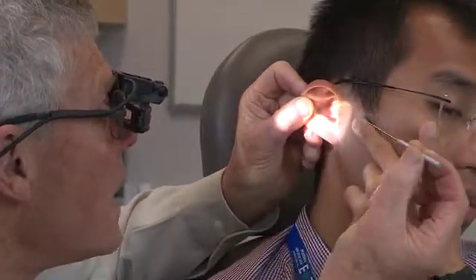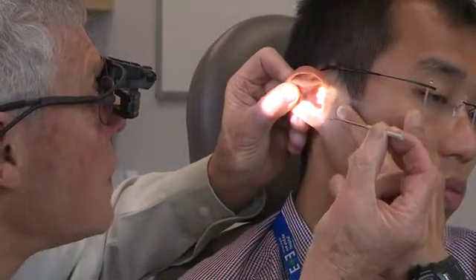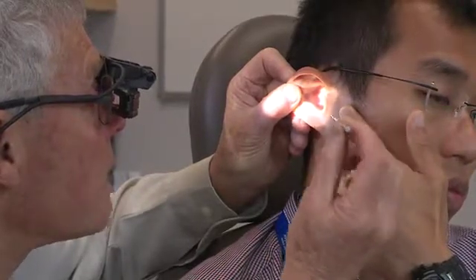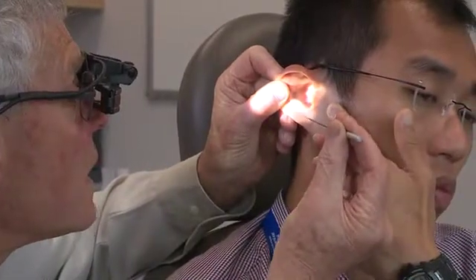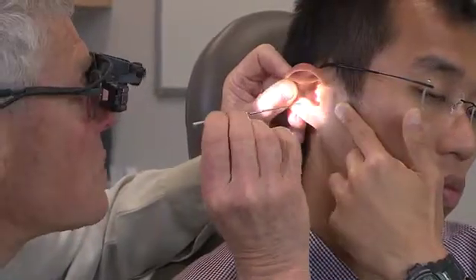So it's a really good habit. We found out the hard way that the best control is with thumb and two fingers — three total, not four, it just gets in the way; not two, it's not stable enough. Three, and it should be the tips. If it's held further back like that, you will still not see as well as you should. You should be able to see down the shaft of the instrument.